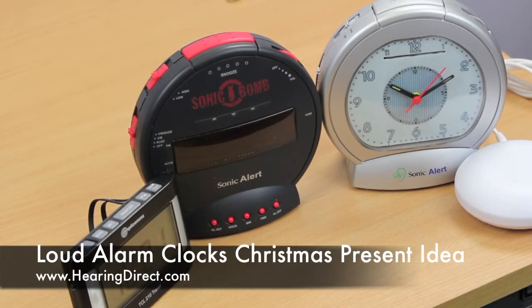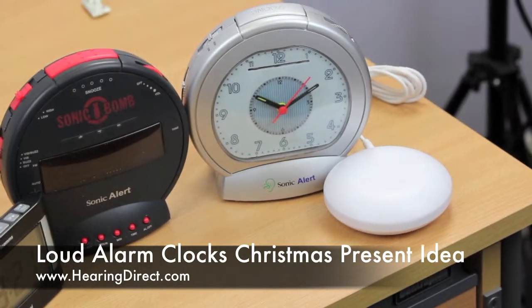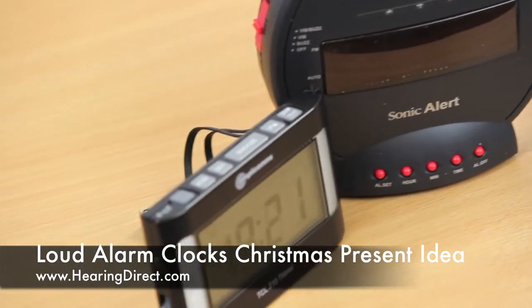This is a range of amplified alarm clocks. If you're wondering what to buy someone for Christmas, consider one of these presents, which may be a little bit unusual, but it will certainly ensure that they get up in the morning.